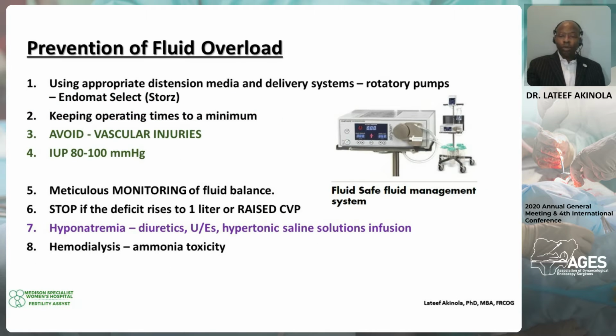The most important point about the distension media you are using is how to prevent fluid overload. And as we said earlier on, using appropriate distension media is important, and of course you need to use it with a good fluid management system like the Endomat from Storz or Hysteromat from Storz that's got rotary pumps that keep the pressure and the flow rate constant for you, giving you good visualization. You have to keep your operating times to a minimum. This is important to avoid fluid overload.